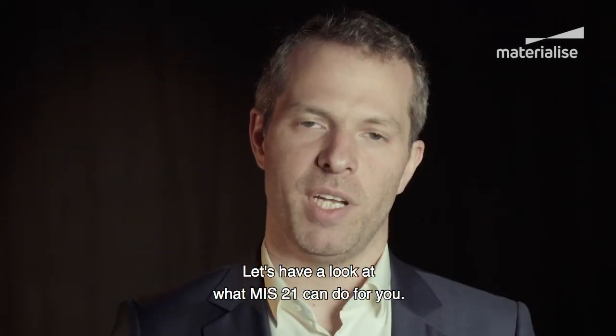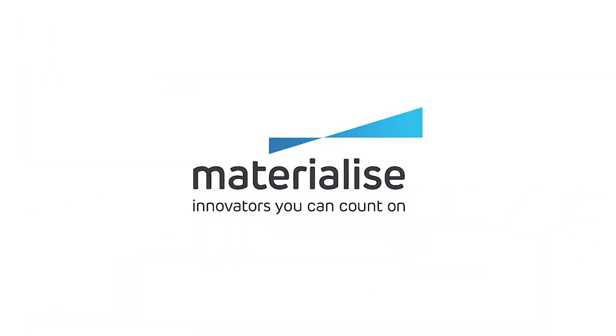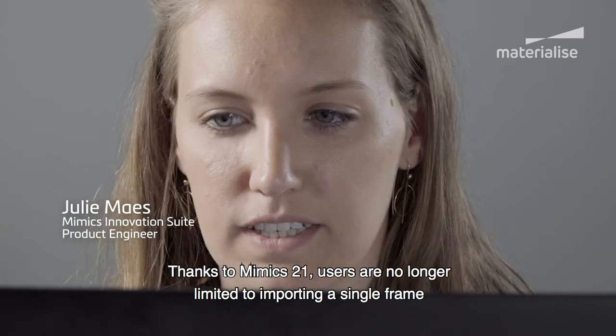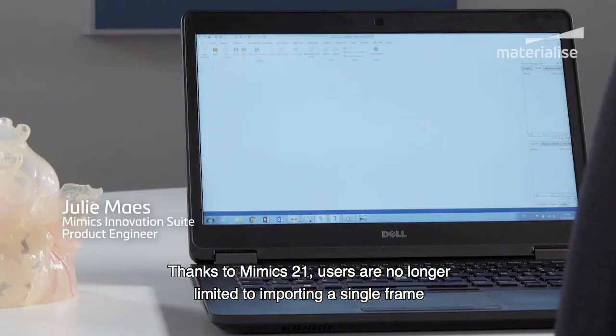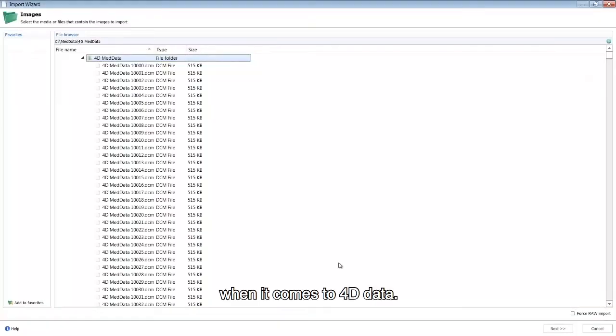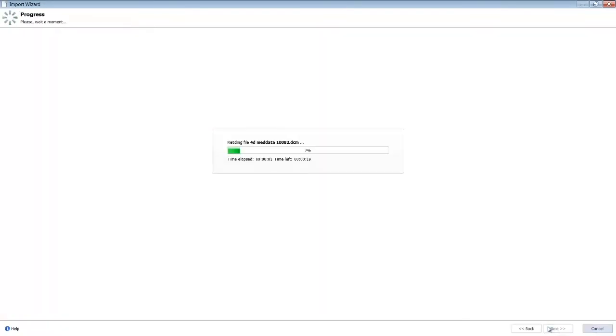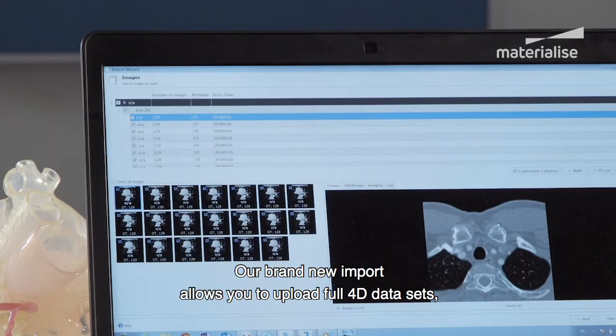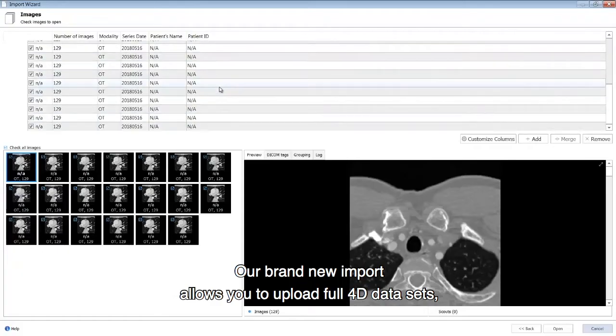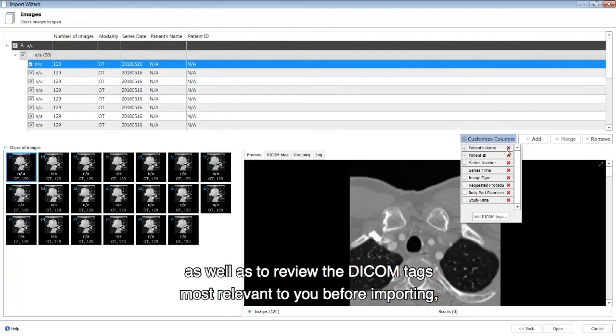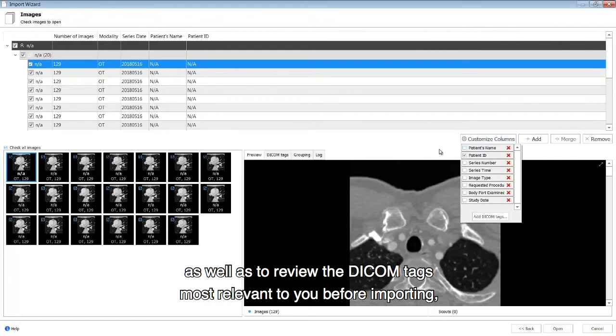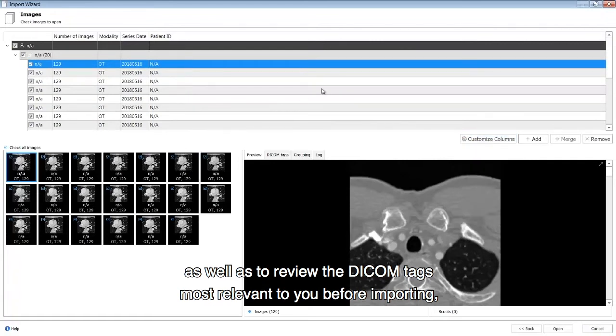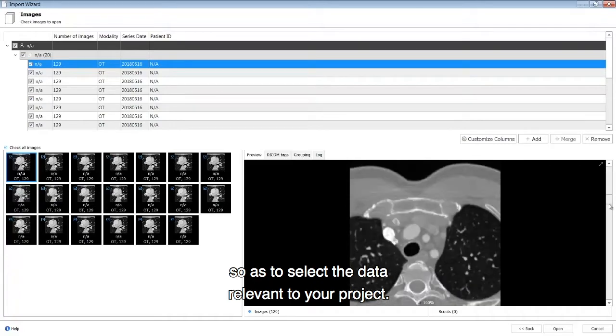Let's have a look at what MIS21 can do for you. Thanks to Mimics 21, users are no longer limited to importing a single frame when it comes to 4D data. Our brand new import allows you to upload full 4D datasets as well as to review the DICOM tags most relevant to you before importing, so to select the data relevant to your project.